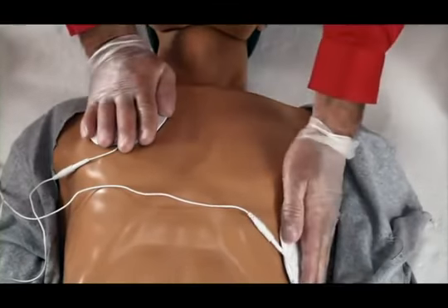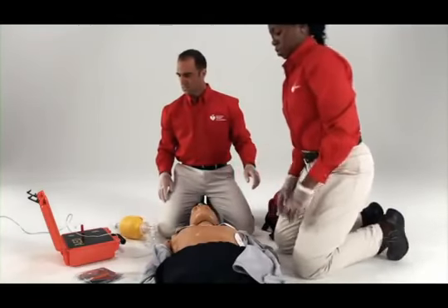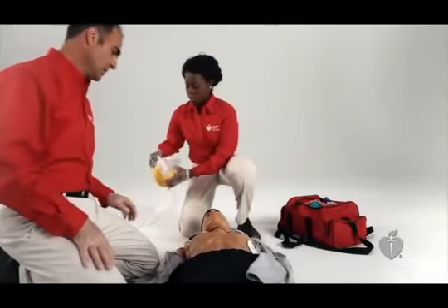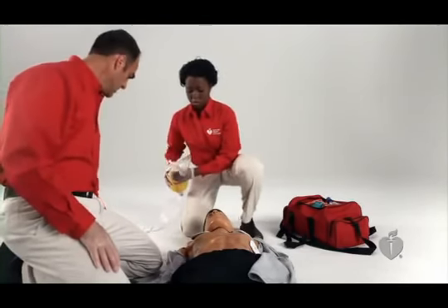If instructed by the AED, clear the victim and analyze the rhythm. Analyzing heart rhythm. Do not touch the patient. Shock needed. Charging. Stay clear of patient. Press the flashing button. Clear now. Be sure that no one is touching the victim, not even the person in charge of giving breaths. Ideally, you will pause CPR during or immediately after a set of compressions.